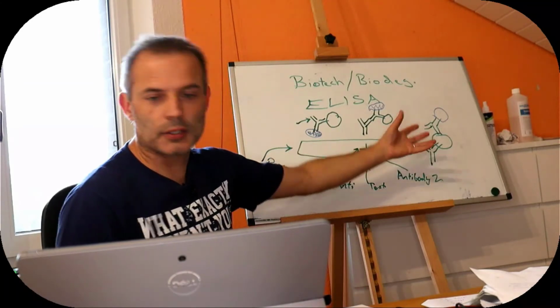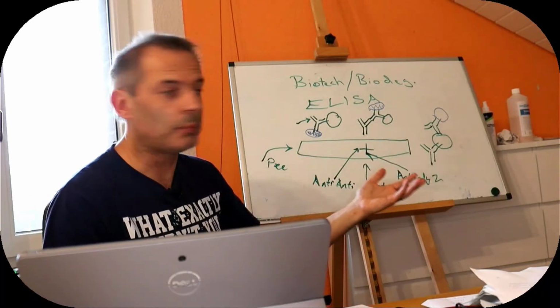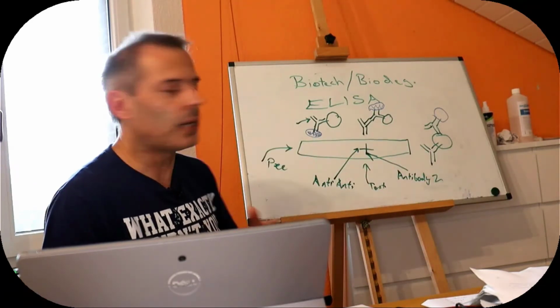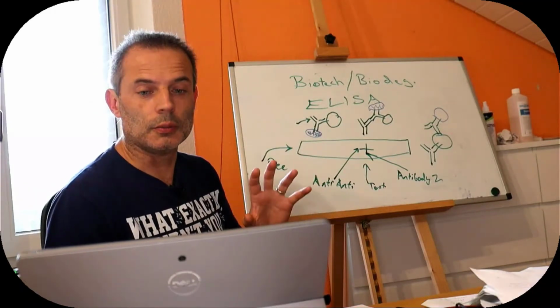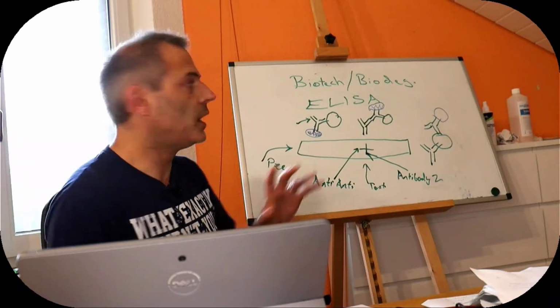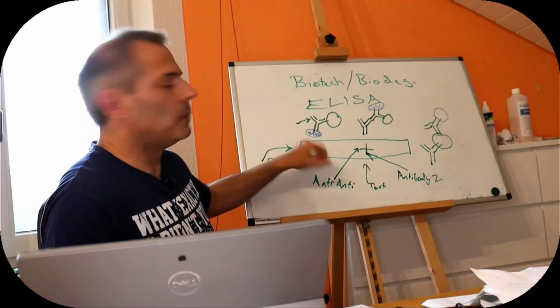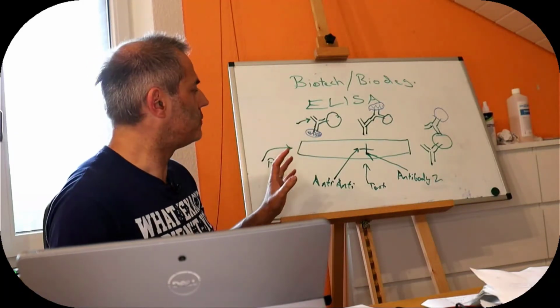So at the top there's some kind of reservoir where it goes in. It's all done by capillary action, so it's just a piece of paper, not normal paper. It's made out of glass fiber, probably because it's easier to manipulate the surface of glass fiber, it's easier to make it sterile, and it doesn't have genetic material itself, so it's not going to interfere.